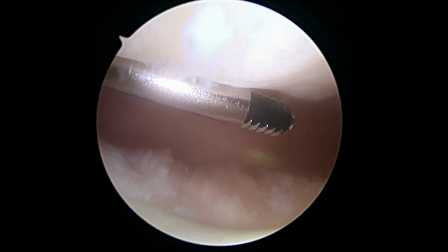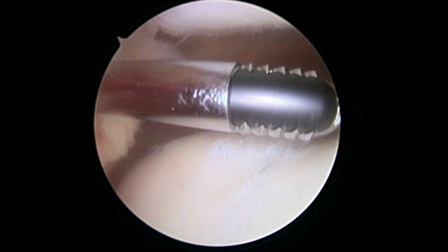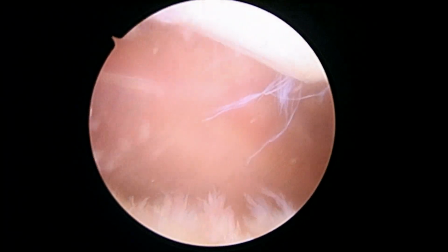There weren't any other significant loose bodies. There were some small pieces of cartilage, but nothing else significant. And I don't see any other defects on the patella. So we're going to go ahead and try and get back down and have a look at this lateral side here. Table up, please. And we'll show you some more in just a minute.